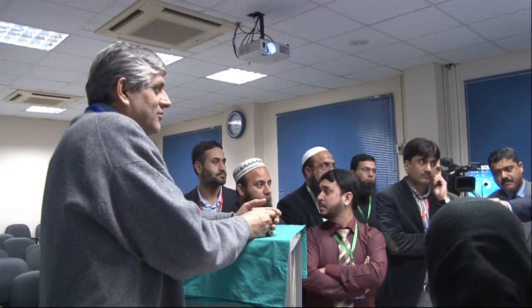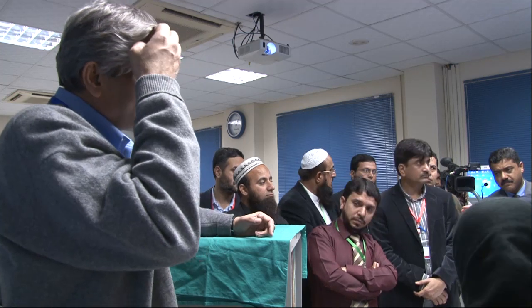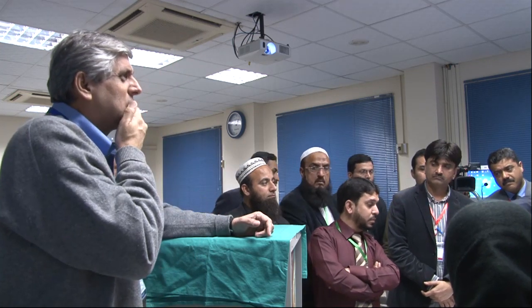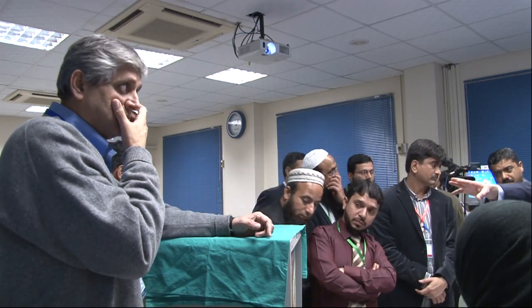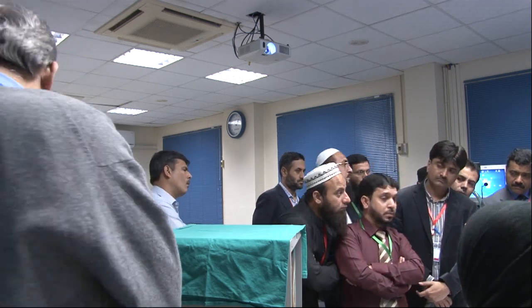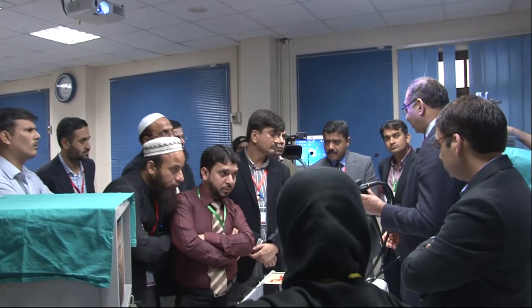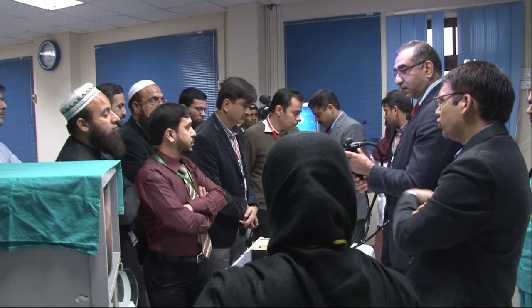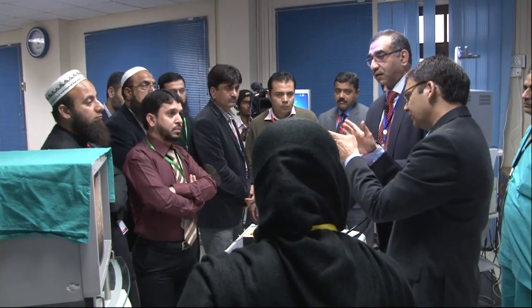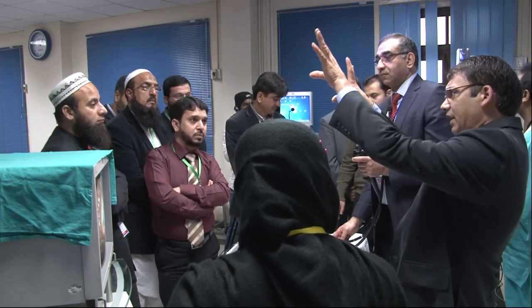Engaging the papilla, the position is also important. I'm trying to get it as best as I can here under the constraints, but it should be toward the top of your field so that when the cannula comes out and is bowed up, it goes straight for your papilla. Now, for the hands-on people, if you start coming around. Those who are observers, the tendency when you are observing is that you are all looking at the papilla screen.